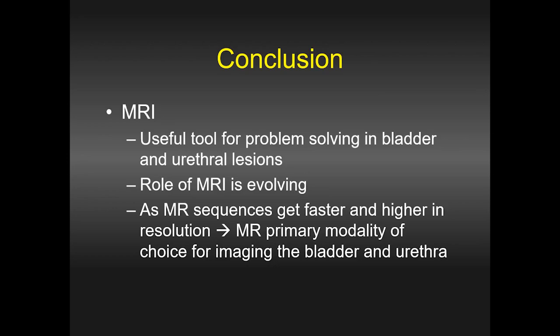And as MR sequences get faster and higher in resolution, it probably will become the primary modality of choice for imaging this particular region.